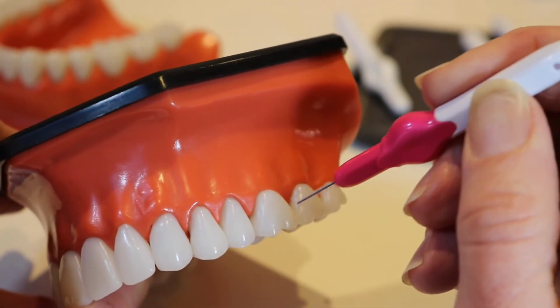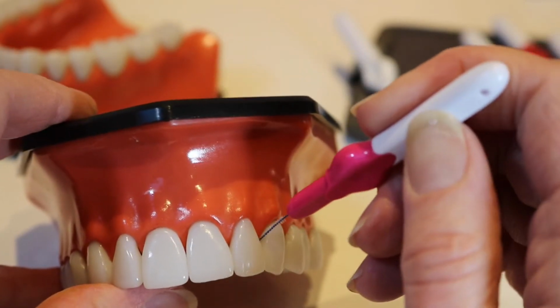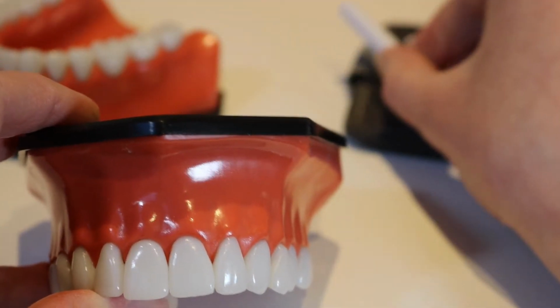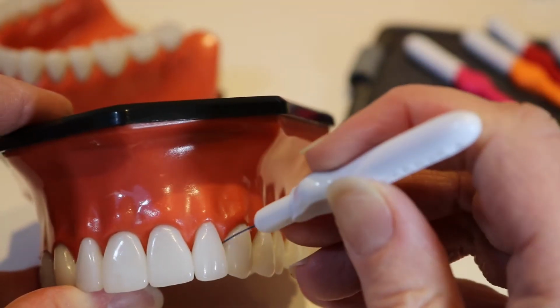So we've already got one for there, we've got one for there, we've got one there, we've got one there, got one there, so we need here, which it doesn't go through, and here, which it doesn't go through. So we'll go to our last size, which is our white one, to our two gaps that we need.